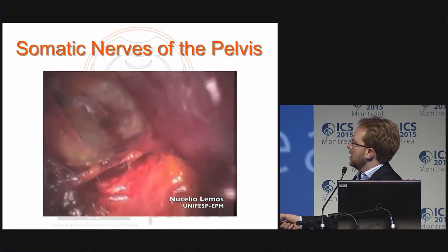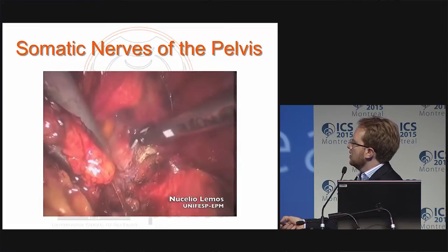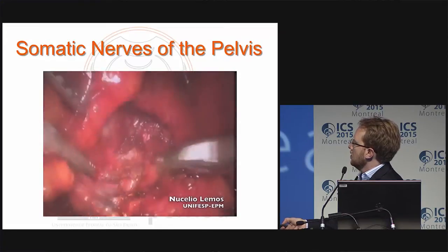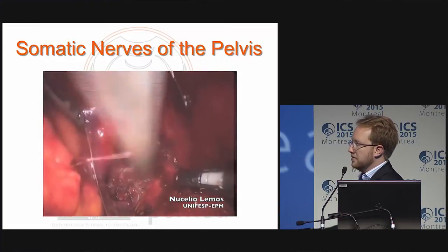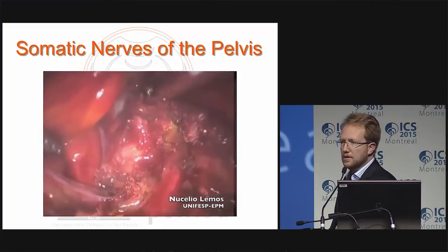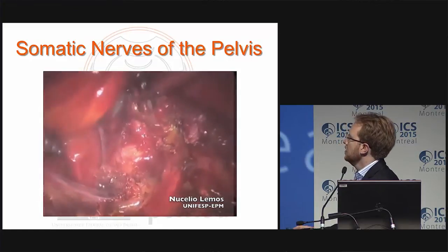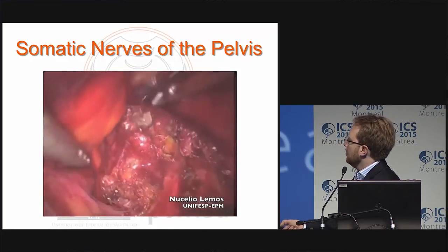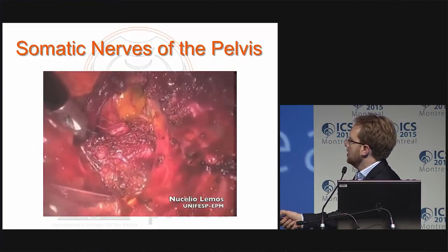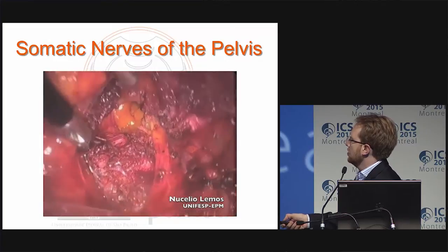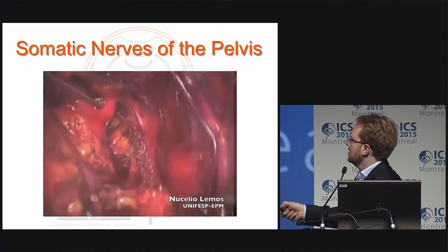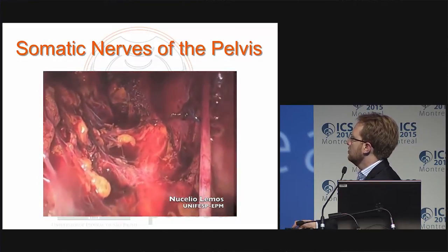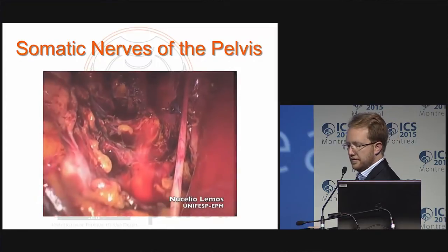I'm cutting the sacrospinous ligament to expose the pudendal nerve. This was a pudendal nerve decompression, but it's very useful to see the anatomy. This is the pudendal nerve, the sacral nerve roots coming together to form the sciatic nerve along with the lumbosacral trunk and the obturator nerve.